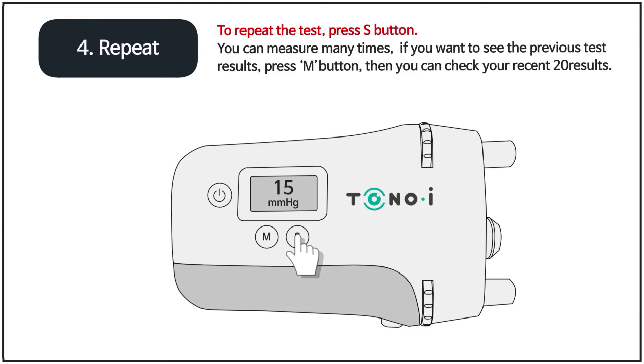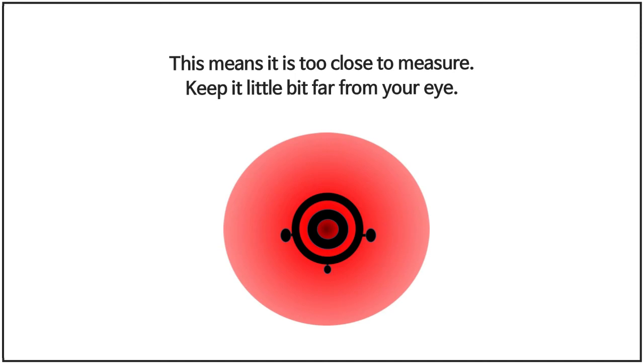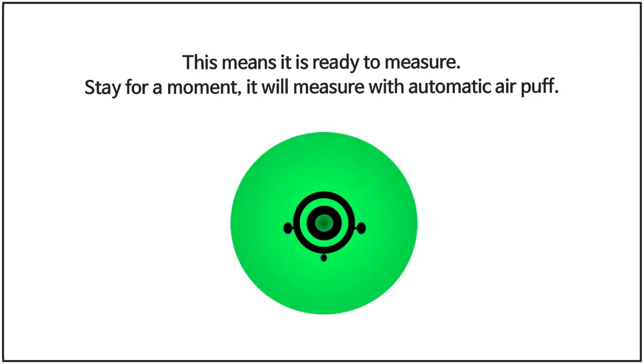If you want to see previous test results, press the M button — you can check your most recent 20 results. If the indicator shows it is too far to measure, make it closer to your eye. If it shows it is too close, keep it a little farther from your eye. When it shows ready to measure, stay for a moment and it will measure with the automatic air puff.